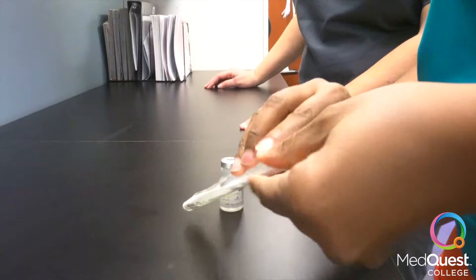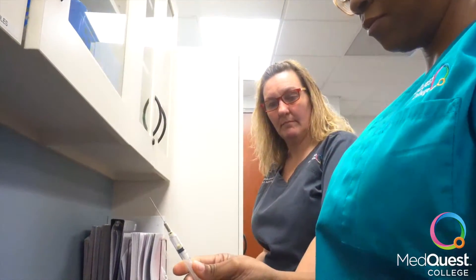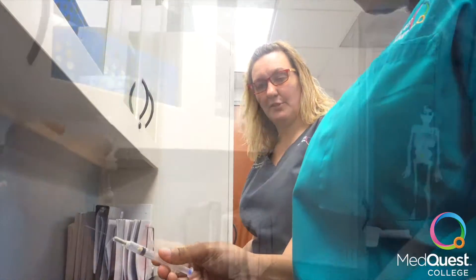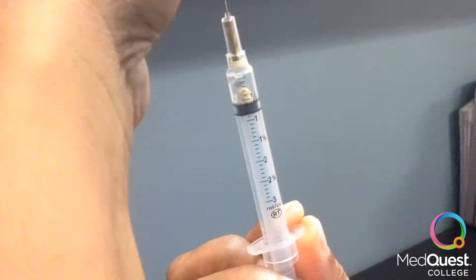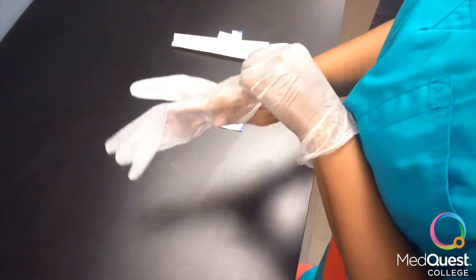Open syringe with intramuscular needle attached. Uncap syringe. Install medication into syringe to proper level. Recap syringe. Now we glove.